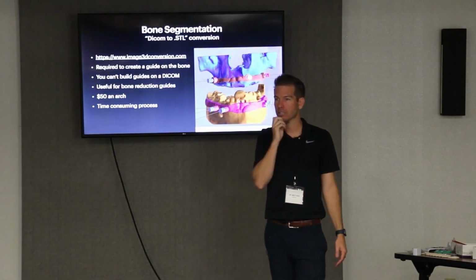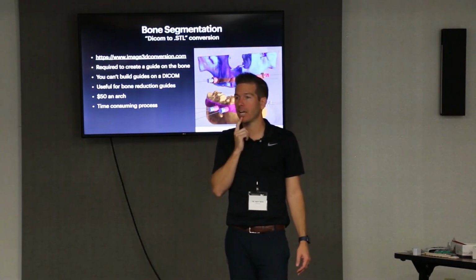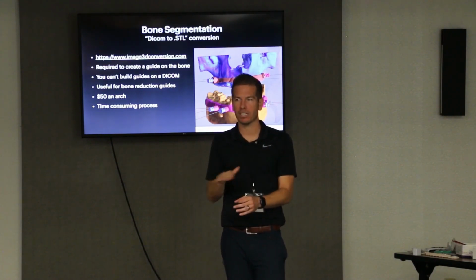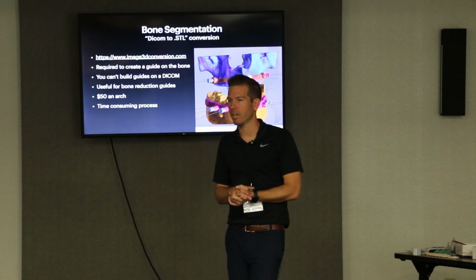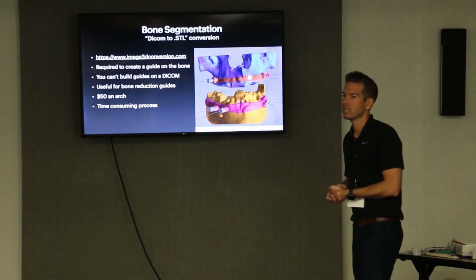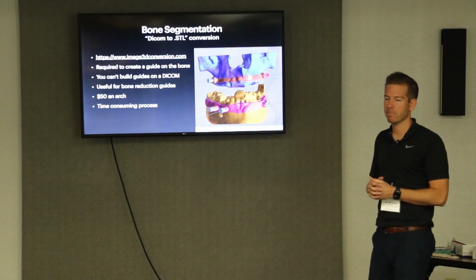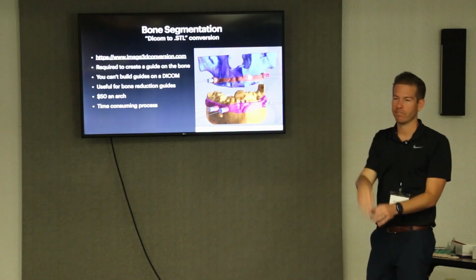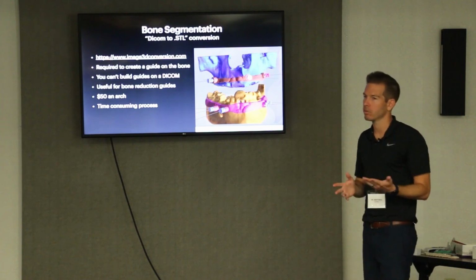Even for the top 1 millimeter, just a chip, I just touch the ridge real quick. That's fine. I do that too. Just where you're not taking it to depth, but just kind of poking. Just that top millimeter, just kind of flatten it. And then I go in with my 2.0 and start. Yep, that's fine too. Same as a round burr. That's probably even better. Yeah, the round burr, it's kind of case by case, but if you can do a little round burr, now you don't even have to think about it because it's just going to find that hole. It's just going to go straight into that hole, and the case will go well.